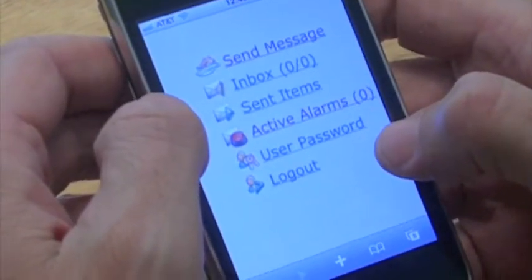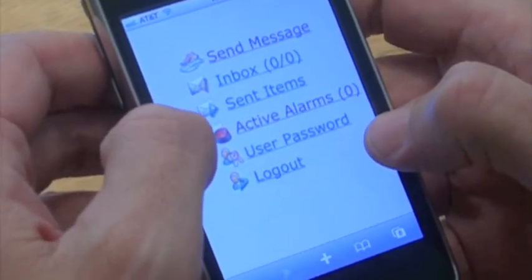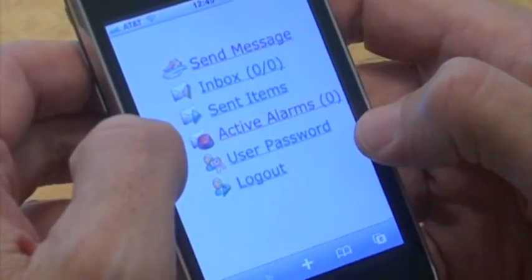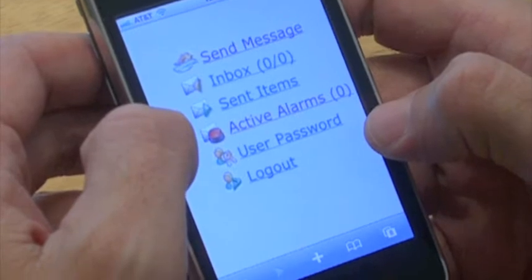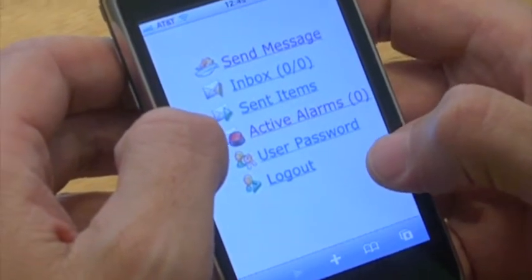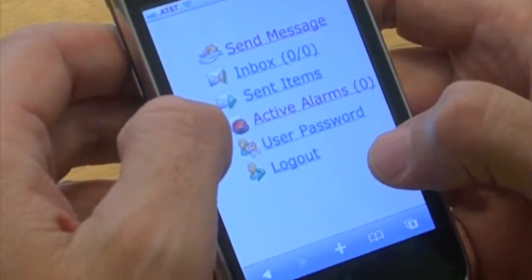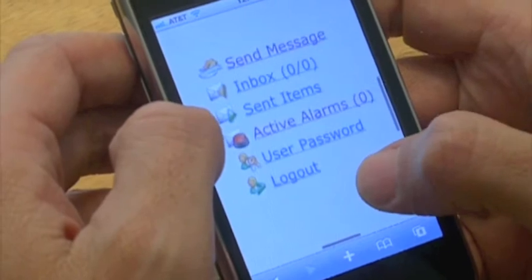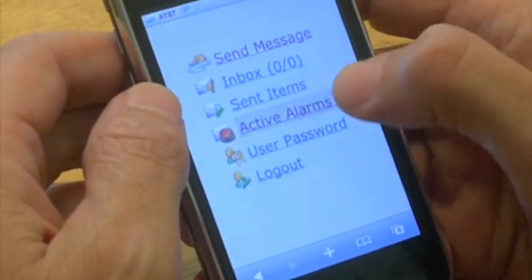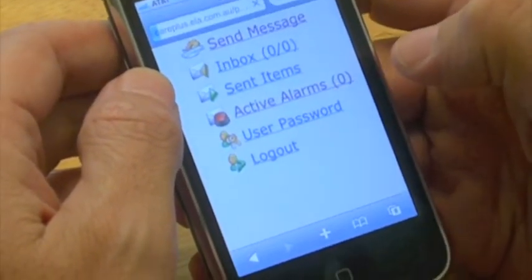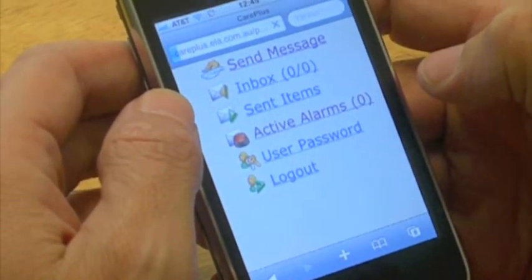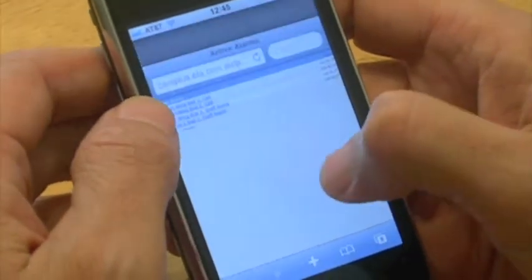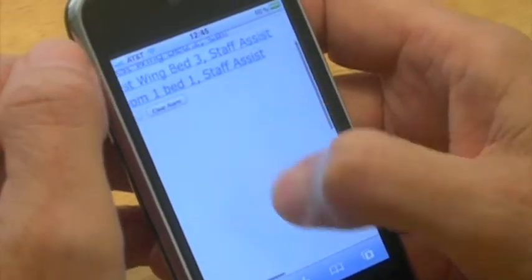We're just demonstrating the capability to have a look at the alarms on an iPhone within the Care Plus Nurse Call information system. Over here we're just looking at the capabilities that we can see on a smartphone and PDA, and we're just going to have a look at the active alarms on a ward.